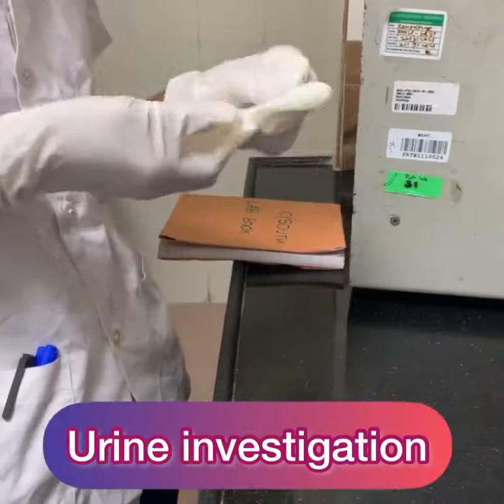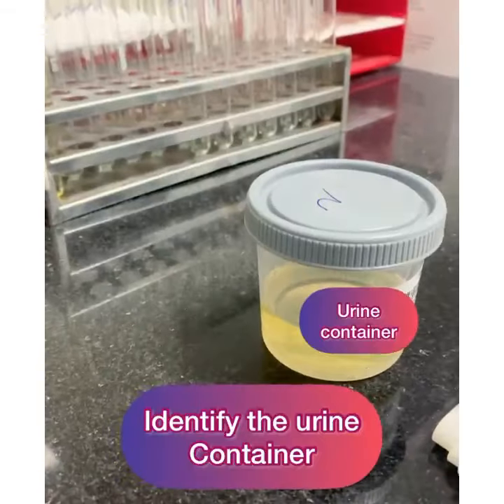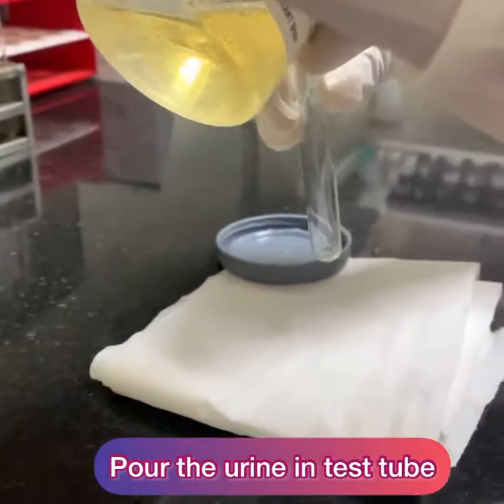For urine investigations, first wear the gloves properly. Take the bottle of urine, unscrew the bottle, and take the contents into a test tube for simplicity of investigation.